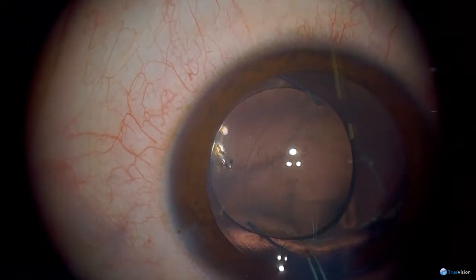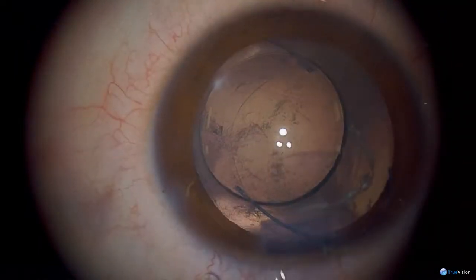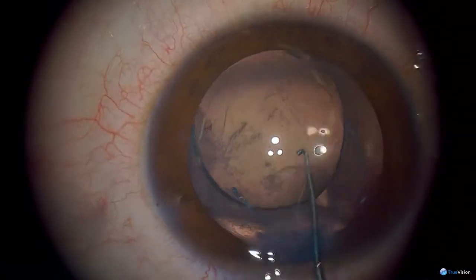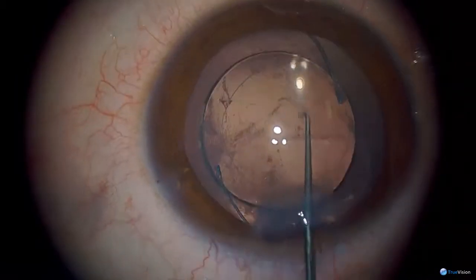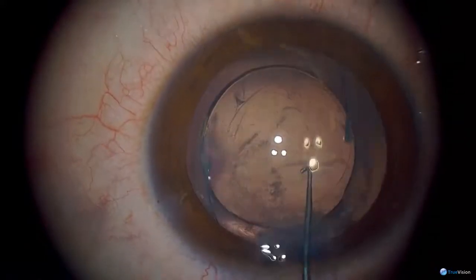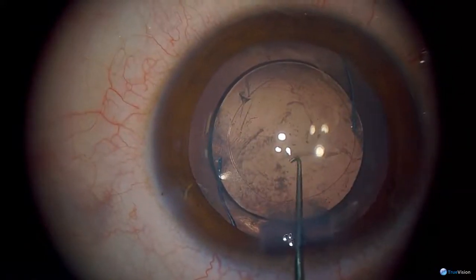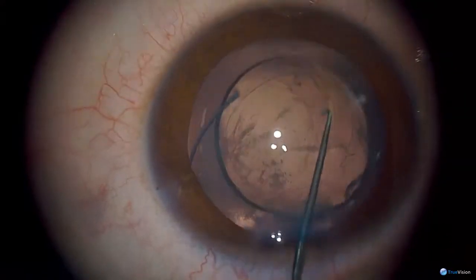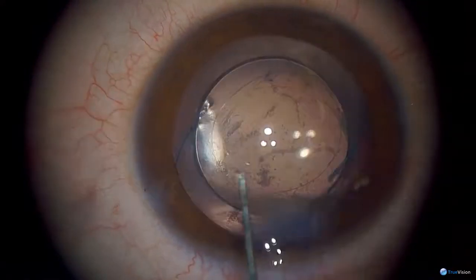In an older child you can leave it — if they're eight or nine and cooperative you can just do a YAG laser later. But why do you put the IOL in first? Sometimes if you don't, the leg of the implant can go into the vitreous. There now is the posterior rhexis.